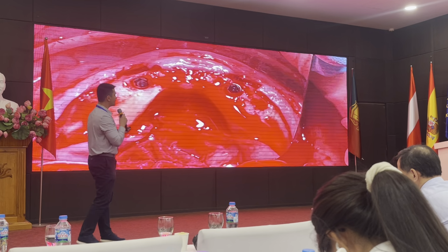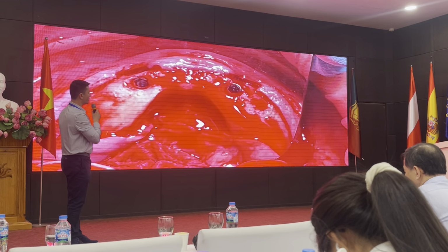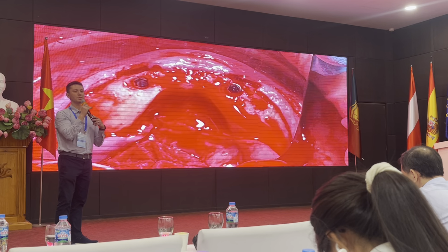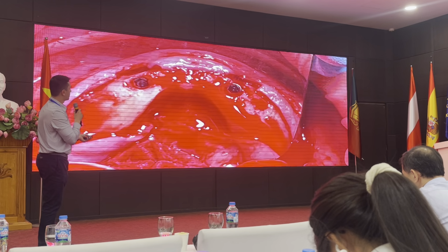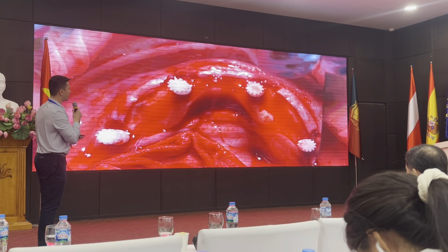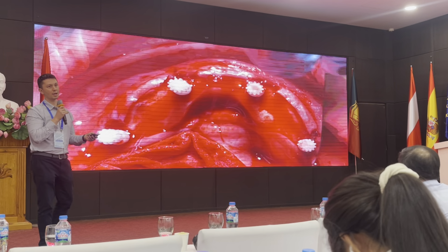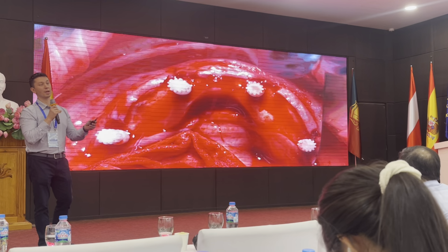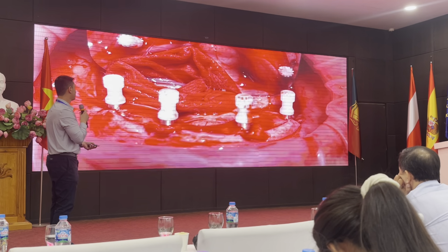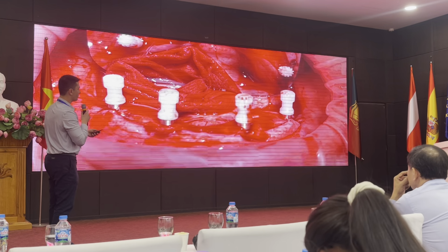I would like to have at least 12 millimeters of restorative space for this implant locator overdenture, in order to have bulk strength for the material and structural integrity of the denture. Sometimes if the denture is too thin and they're chewing on something with their new implants and they feel great about it, the denture will crack and break, and they'll be upset because now they have to pay for another one or come in to get a new one made. Sometimes you don't know until you know. So this is planning for the future.